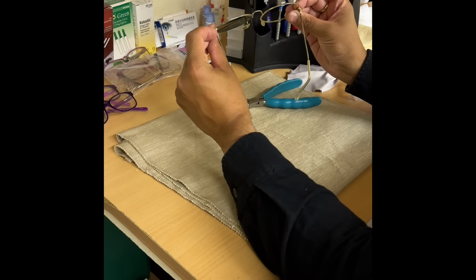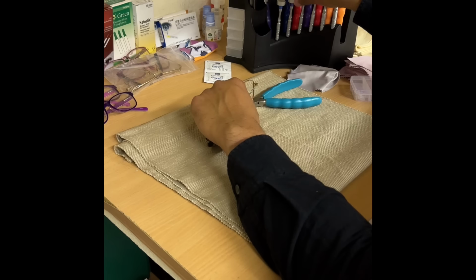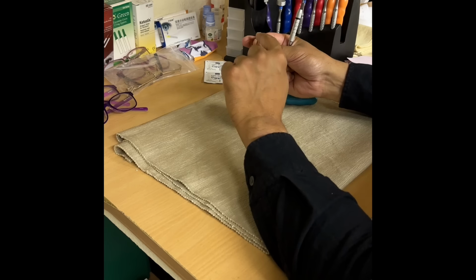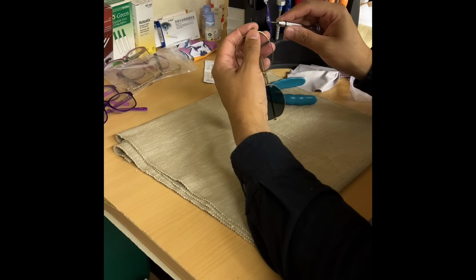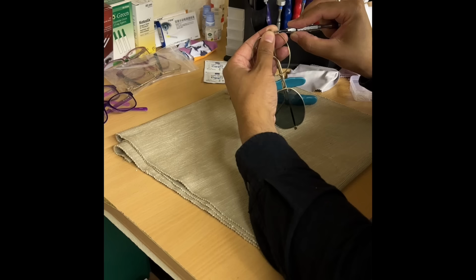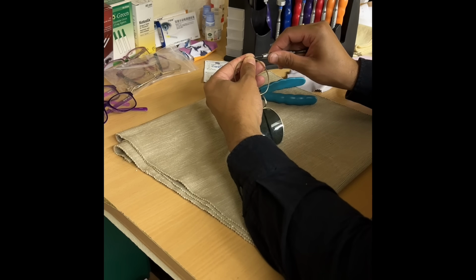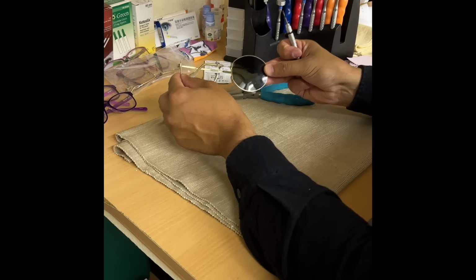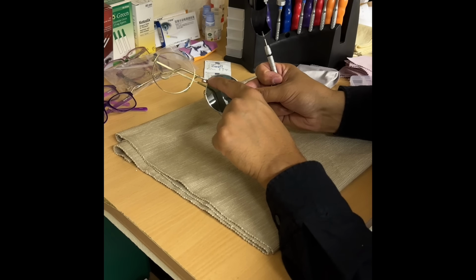The sides are a bit slack. Let's have a look at the joint. Flathead. So, two joints are very close together. So what we'll do with these, once we've seen to them, we shall replace the lenses for you. Two new pairs, because you can see on this one you have chipped the lens on the nasal side there.